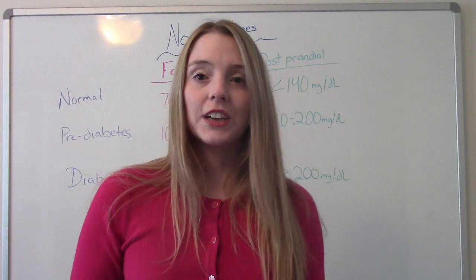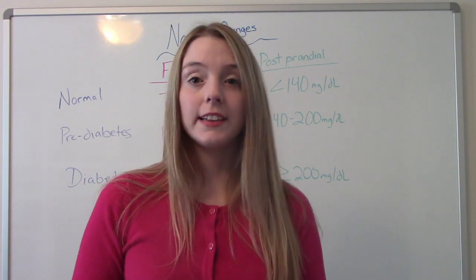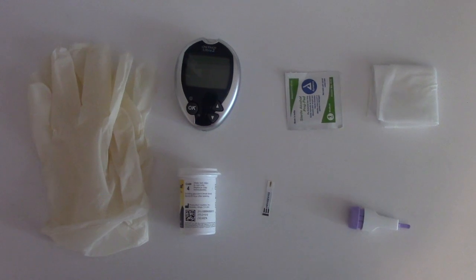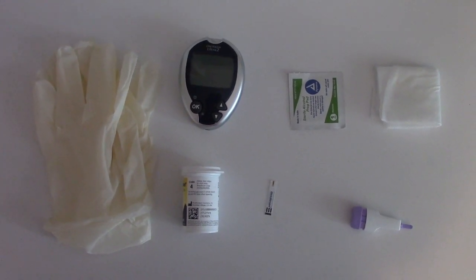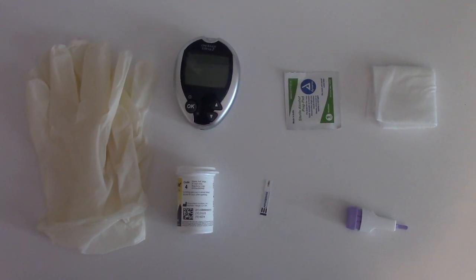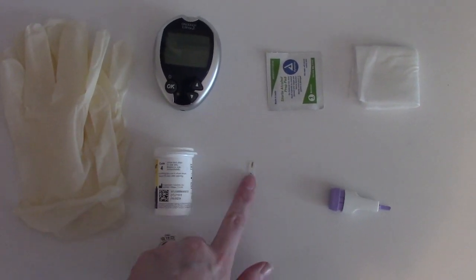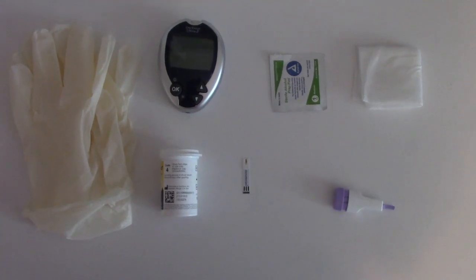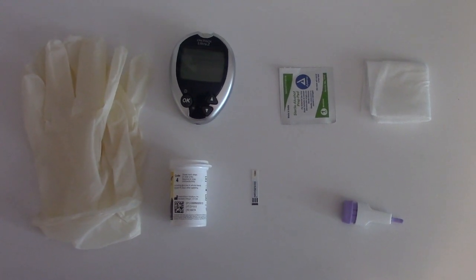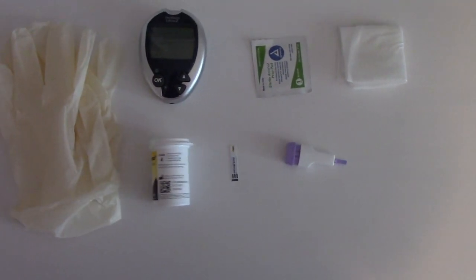Now I want to show you the supplies you're going to need to take a blood sugar before we do our patient scenario. You'll need a pair of gloves because you're going to be exposed to blood and you want to protect yourself. You need the glucometer, which is the device that actually reads the blood sugar. You need test strips — make sure they are compatible with your glucometer — an alcohol wipe, some gauze, and a disposable lancet, which is what we're going to poke the patient with.